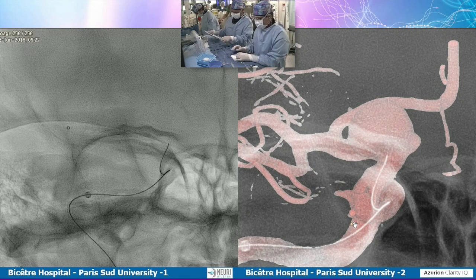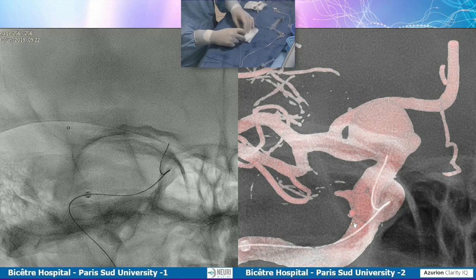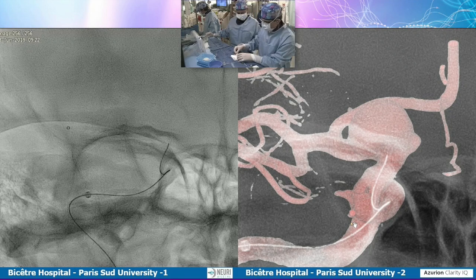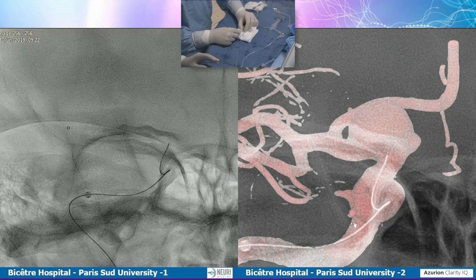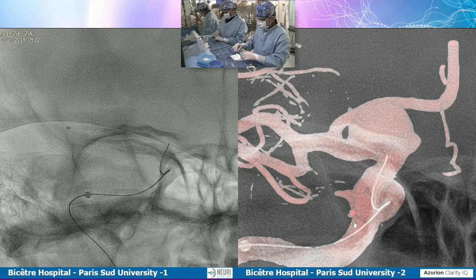So the stent is an EVOLVE, the new one from Stryker. It's a 4.5 by 17. Jacques, correct me if I'm wrong, but previously it was a common practice to get the distal access catheter like CAT5 itself cross the aneurysm and then get your delivery catheter through it. And so this is the new generation which probably circumvents coiling or push to stent to prevent the premature rupture.